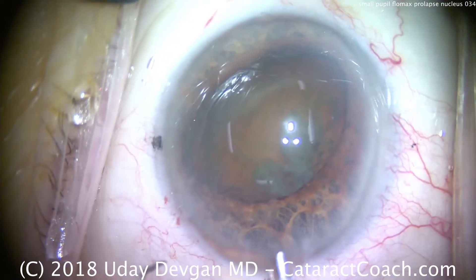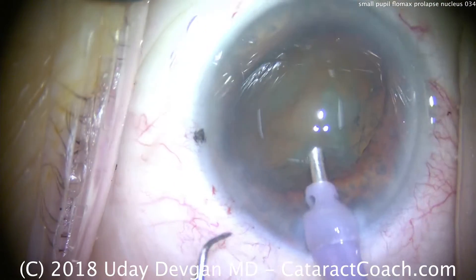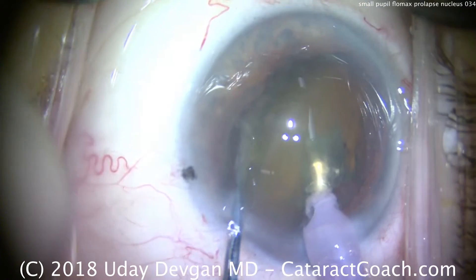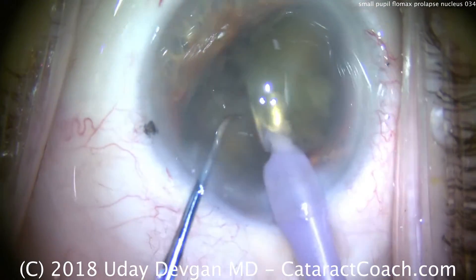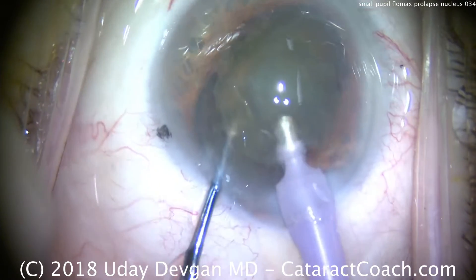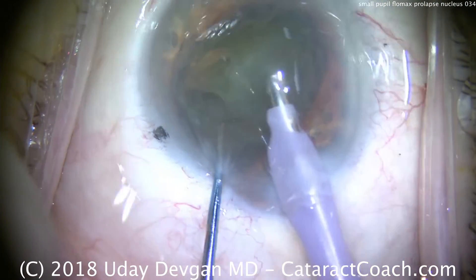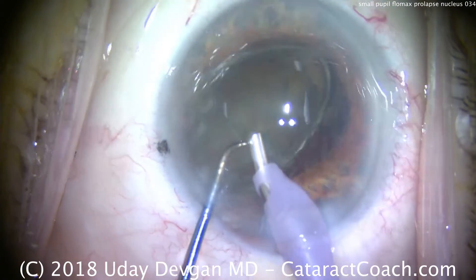The iris is being held open by the cataract. The phaco probe is placed in the eye, along with the chopper. We buzz in with the probe, bring the chopper across, and chop it right in half. There are the two halves. We use the phaco probe to do a little more aspiration — phaco aspiration with a little ultrasound — and take down that first half. Now we're not at the endothelium; we're at the iris plane — very important. We don't want to ride the endothelium or kill off endothelial cells. We're deeper in the eye.